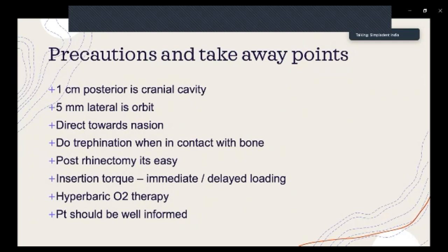Insertion torque. The immediate or delayed loading depends upon the insertion torque. If the insertion torque is very high for the glabella and bilateral zygomas, you can really go to immediate loading with the prosthesis, and the patient can start eating. But if the insertion torque is soft in either the zygomatic implant or the glabella implant, and you need a high insertion torque, which is very important, then you should tell the patient to use the prosthesis only for the social environment and not for mastication. Later do it. Just wait for 4 to 6 months.